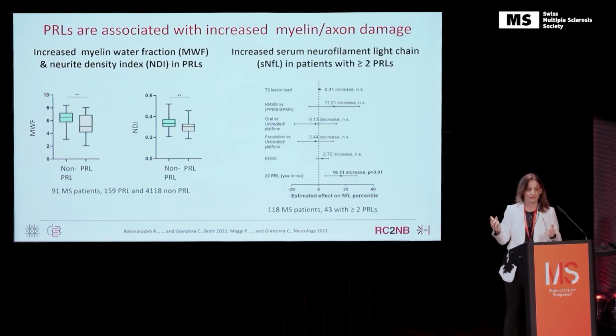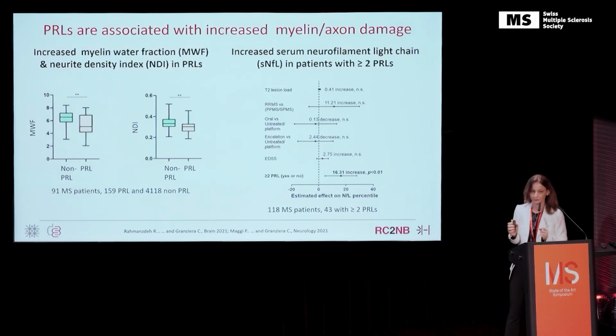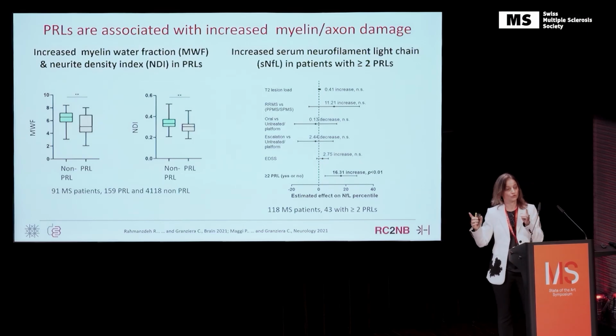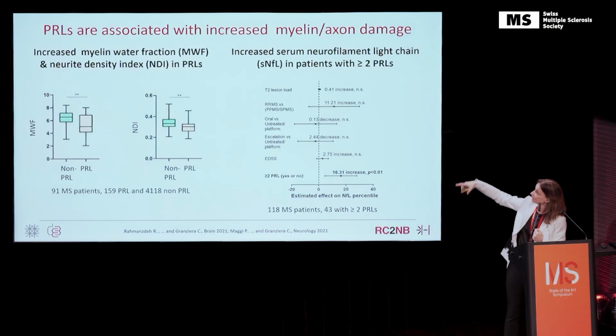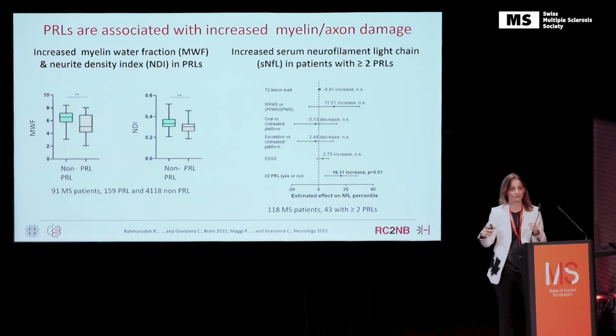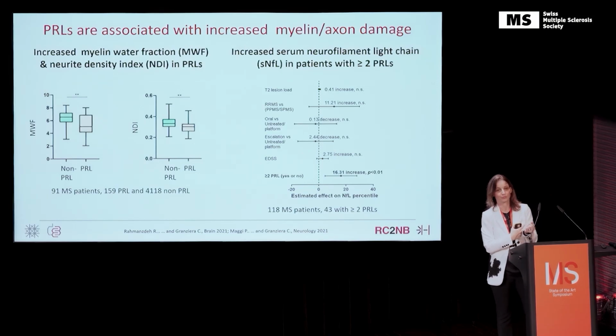And then in a study that we did some years ago between Lausanne and Basel, we also saw that in patients having zero clinical activity and zero MRI activity during the past year, so our stable patients, if you count these lesions and the patient happens to have 2 or more of these lesions, this is the main determinant in this multivariate model of the increase in the serum of this patient of serum neurofilament light chain, which is a neurodegeneration biomarker.